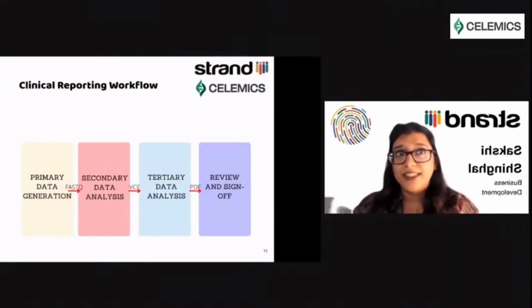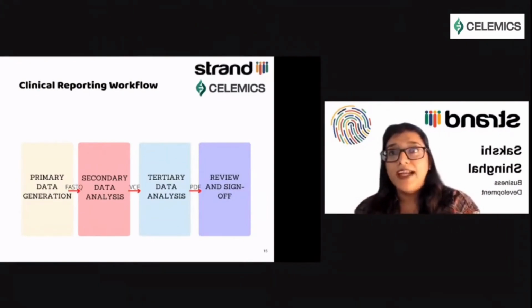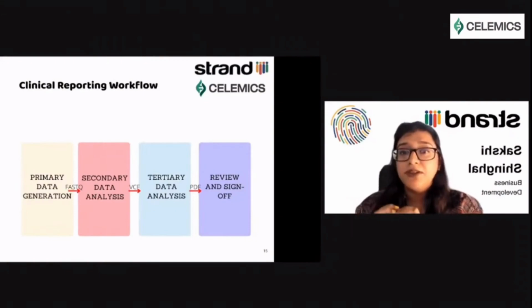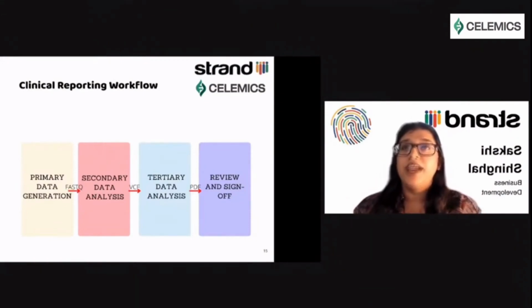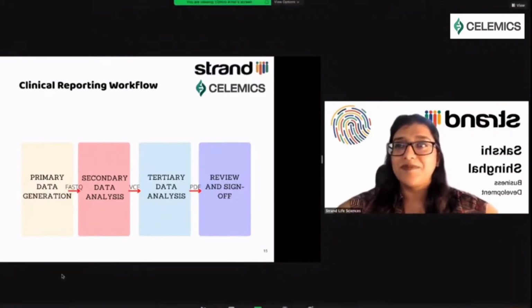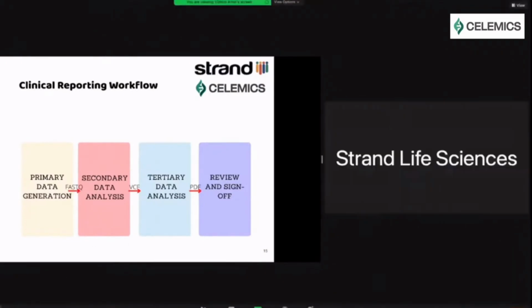Now that we have our VCFs ready and we have our demographic data available, it'll be handed over to Strand, where it can be uploaded to StrandOmics so that our tertiary data analysis can occur, and you can create a PDF, which will then be reviewed and signed off by experts for delivery. I will hand it off now to Urvashi to explain that aspect of everything. Thank you, Sakshi.